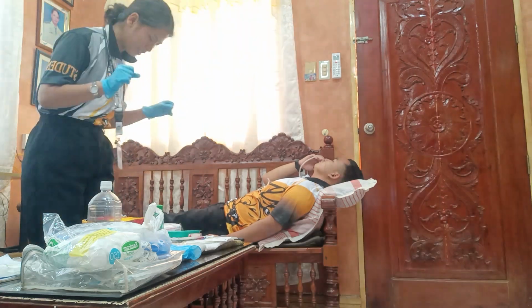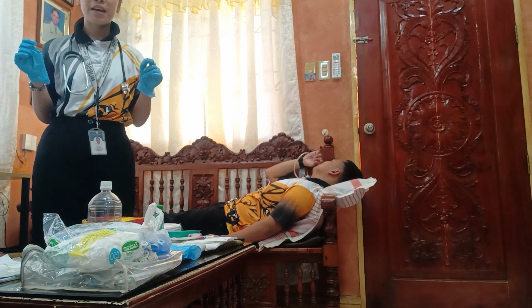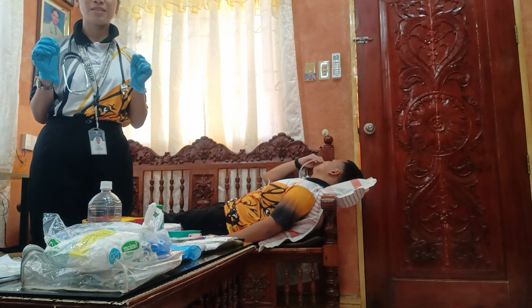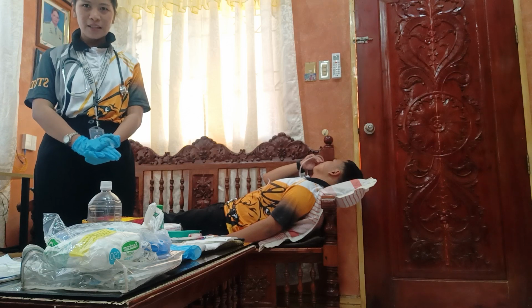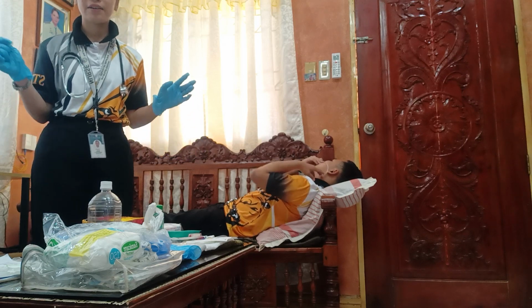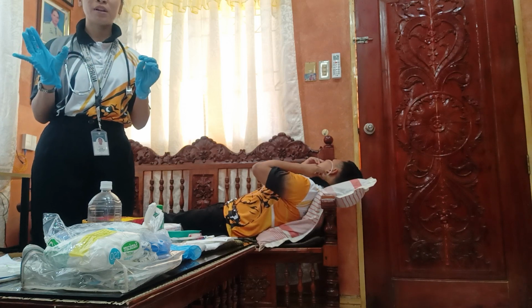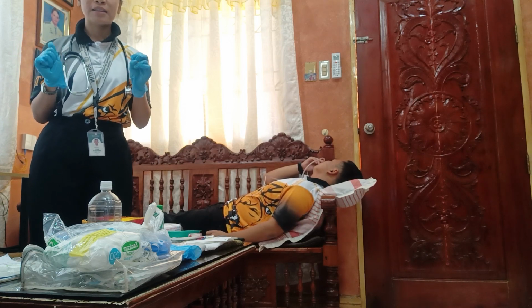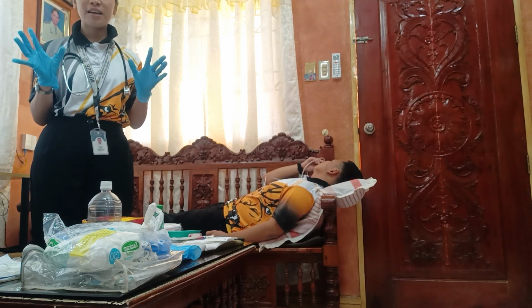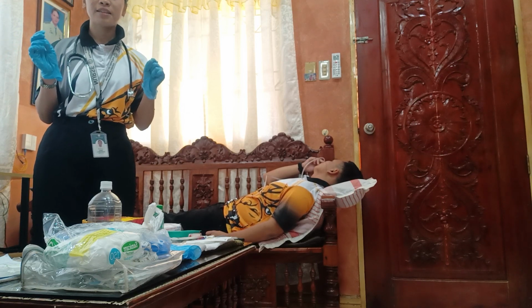when the patient is swallowing. Stop when the patient breathes. If gagging and coughing persist, stop advancing the tube and check the placement of the tube with a tongue blade and flashlight. If the tube is coiled, straighten the tube and attempt to advance again. Keep advancing the tube until the pen marking is reached. And also po is, do not use force and do not rotate the tube if it meets resistance.